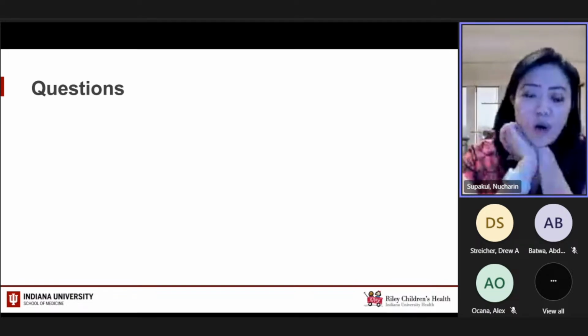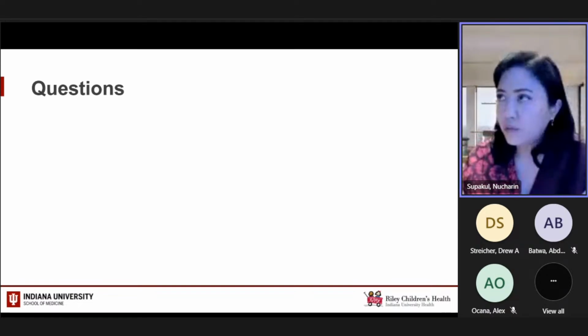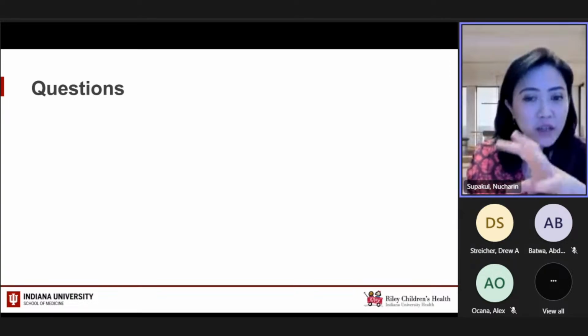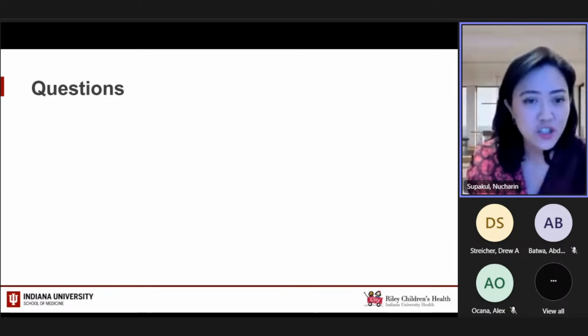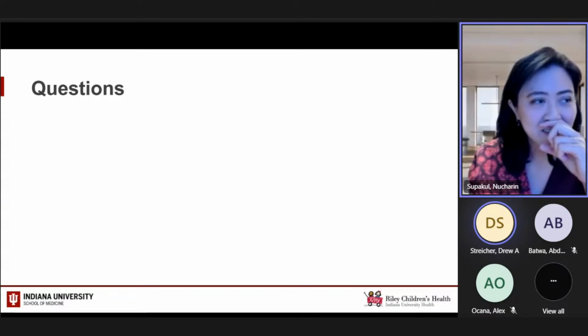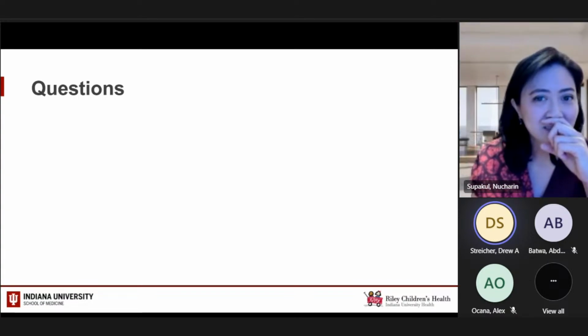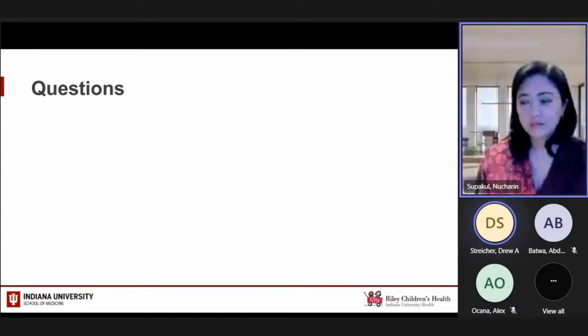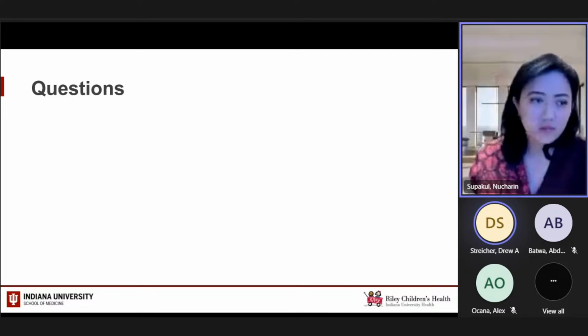I have a question about the protocol for neurocutaneous melanosis. Normally we don't give contrast, but according to one paper that Jenna showed here, they do contrast for the whole CNS. So it's great you asked that, Tanya, because Jenna and I have talked about this numerous times. There's not clear-cut guidelines in the literature of whether or not to give contrast. You'll see sometimes they'll say to give it, but the most recent paper that we found that we thought was well done said without contrast.